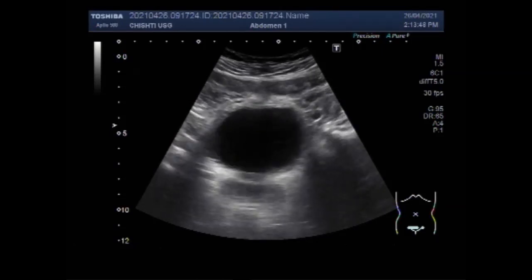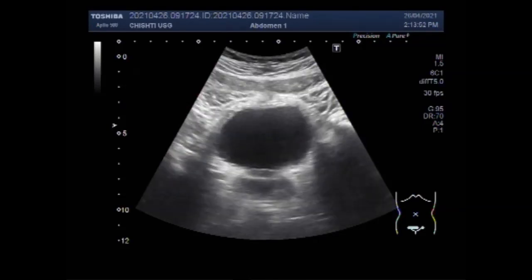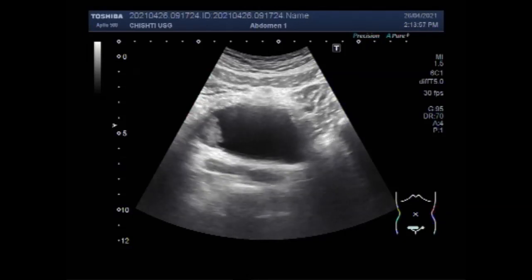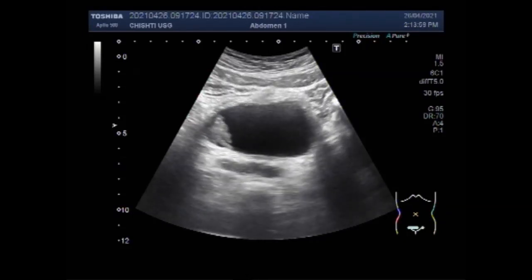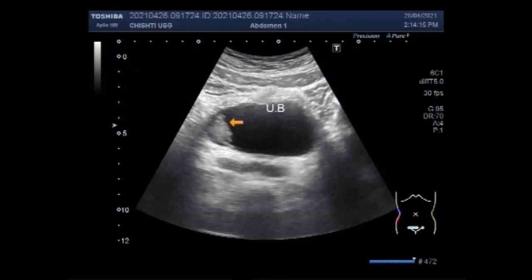Ultrasound scans with a full bladder are mandatory to see all findings. You can see the urinary bladder, and a mass is seen along the left lateral wall of the partially filled urinary bladder. Tumors can either be benign or cancerous; bladder cancer and bladder tumors are relatively common.